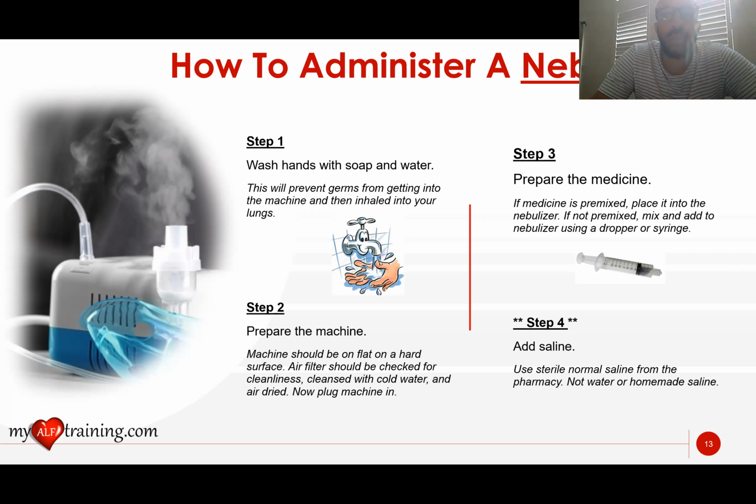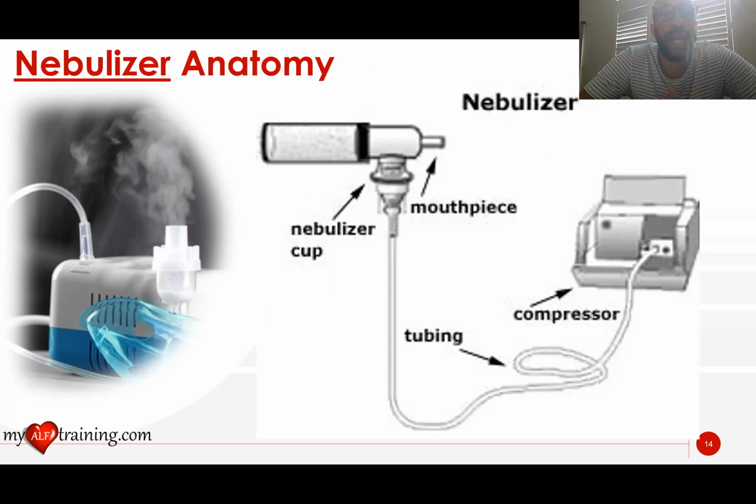So these are the proper steps in administering a nebulizer. It's not a lot, it's very simple, but we have to make sure that we follow these because nebulizer treatments are sent directly to those patients' lungs. So I included this again.